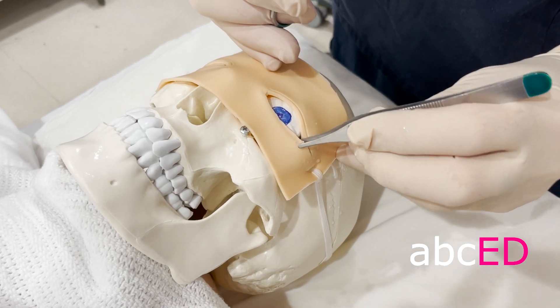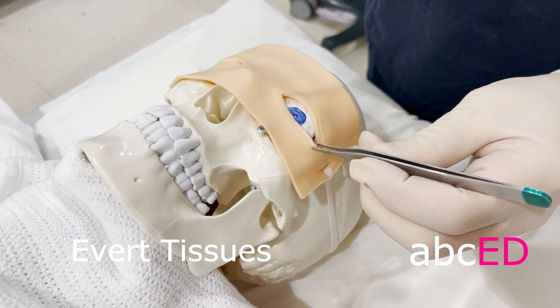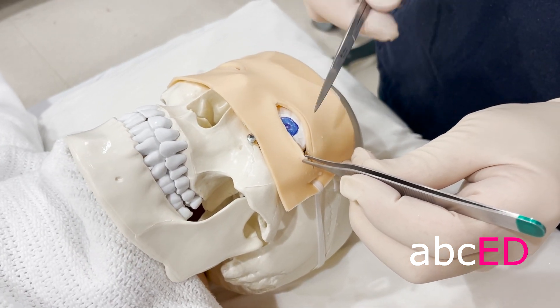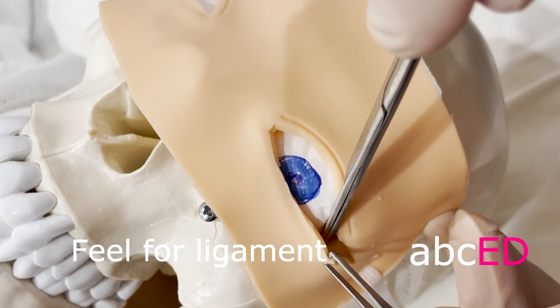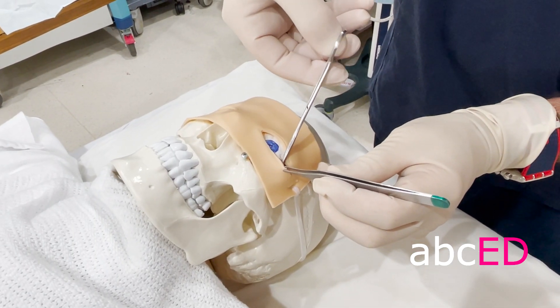Get your toothed forceps in and evert the lower section of the lateral canthus. Now what you want to do is feel for the inferior crus of the lateral canthal ligament — I'm strumming. It feels like a tight band there. I'm just strumming those lateral canthal ligaments.